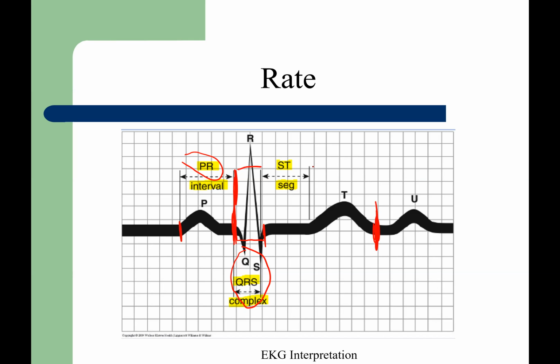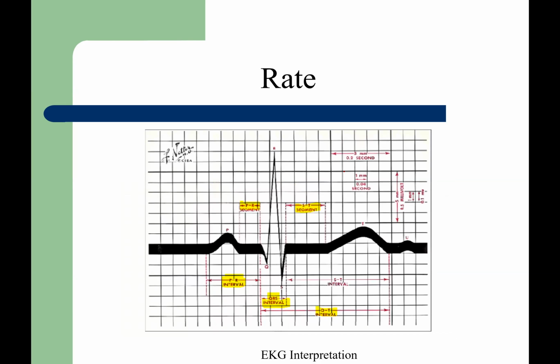Right in there, that would be our QT. There it is right here, our QT interval, our PR interval, and then our QRS interval, our QRS complex.